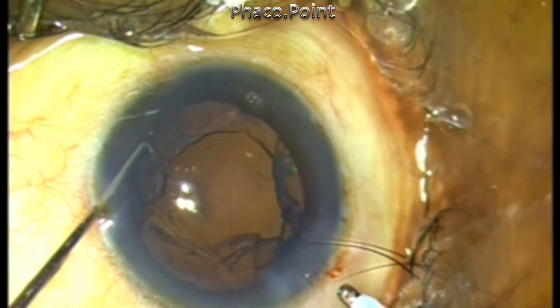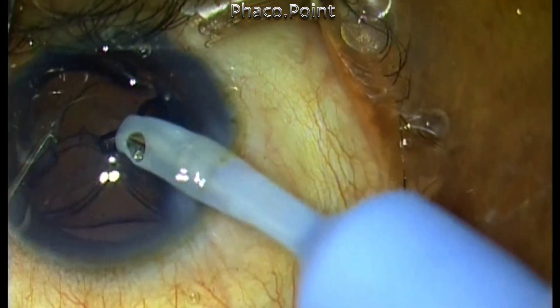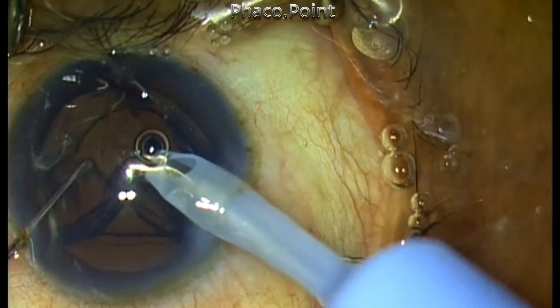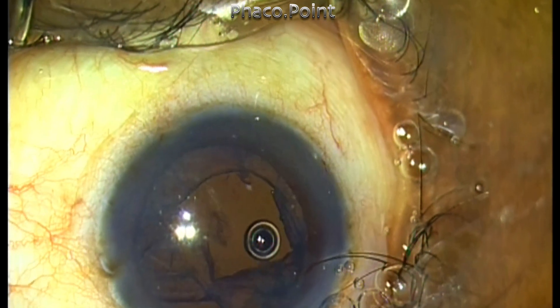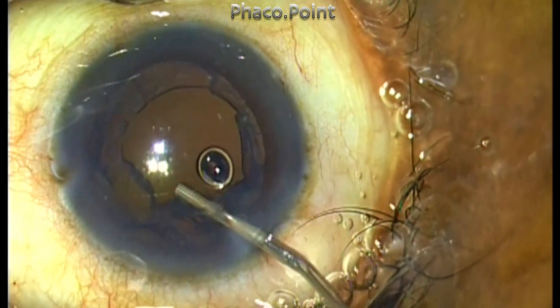The most important pressure point is that you may catch the anterior capsule and create a large zonular dialysis, as I did in this case. This does not happen all the time. Here I was being a little fast and reckless, creating a zonular dialysis superiorly when trying to remove the sub-incisional cortex — I held onto the anterior capsule instead of the cortex.